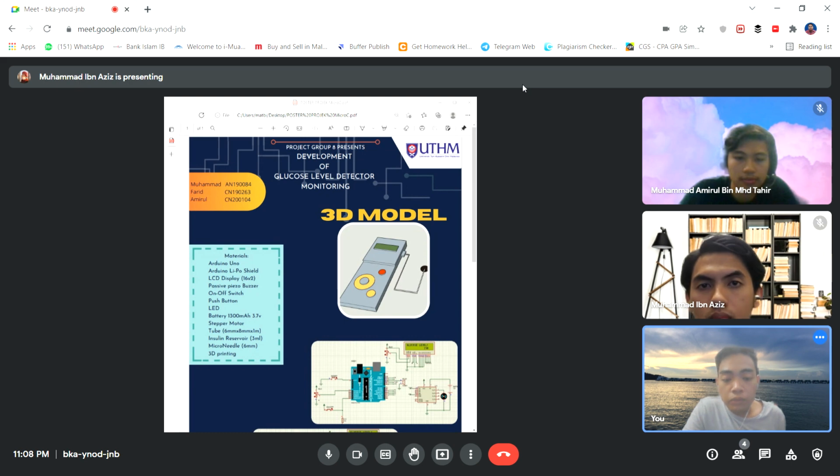Monitoring the blood glucose level as a disease marker has shown an increase in life expectancy by allowing diabetics to manage periods of hypoglycemia or hyperglycemia, giving them more control over their condition. It also eliminates the devastating side effects.